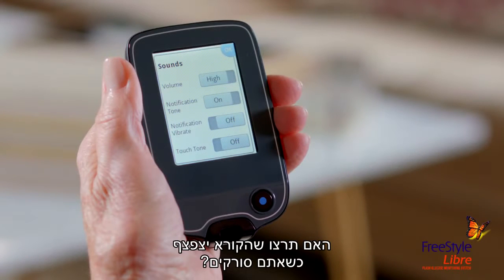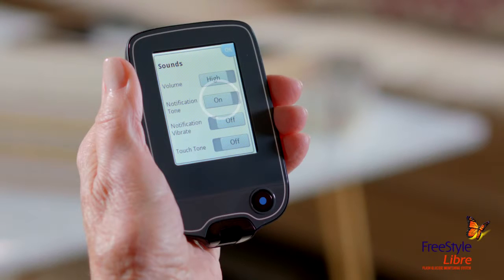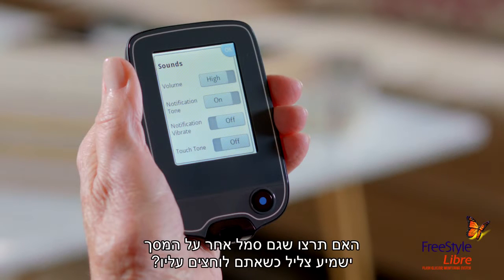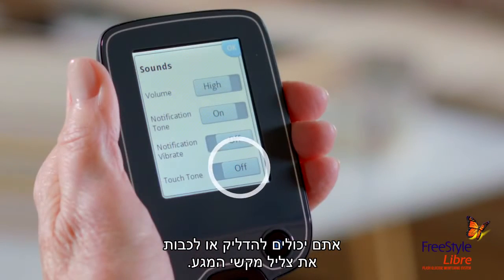Do you want it to beep when you're scanning? You can tap Notification Tone on or off. If you want it to vibrate, you can tap on or off. Do you want any other icon on the screen to make a sound when you tap it? You can tap Touch Tone on or off.